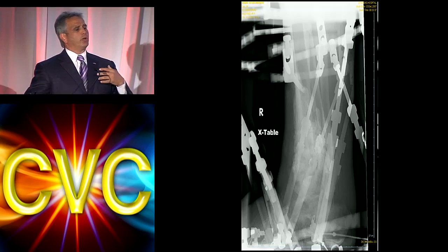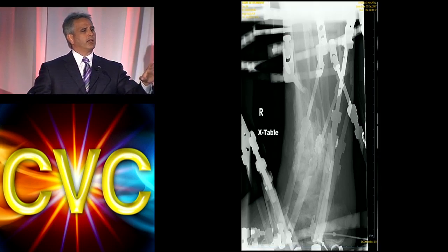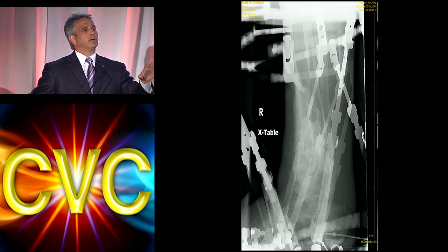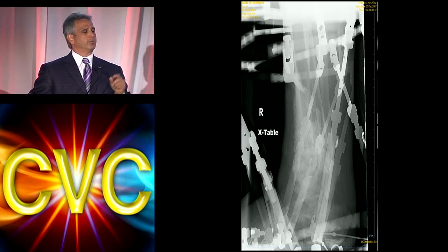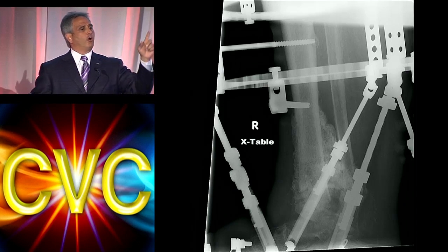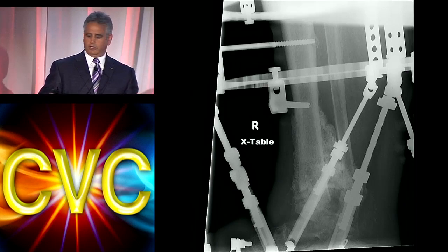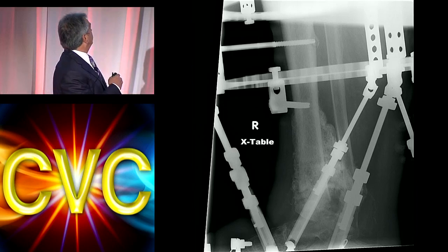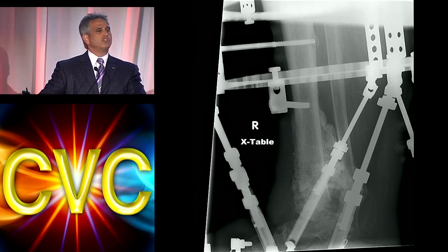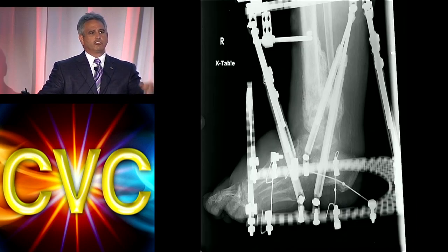So you're just following here, and all I did was get flow restored, get an antibiotic to the area, open it up so I could drain it, but all I did, very simply, was put him in an external fixator and bring him out to length. The body followed its own periosteum and rebuilt, as you can see here, this whole roughly 8-centimeter piece of bone, regenerated, okay? And you can just see following through.